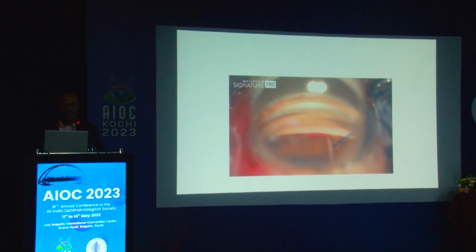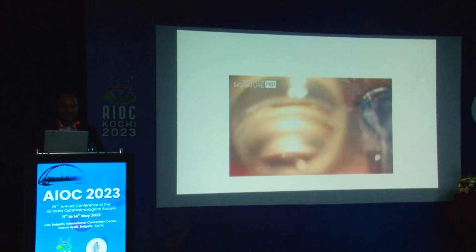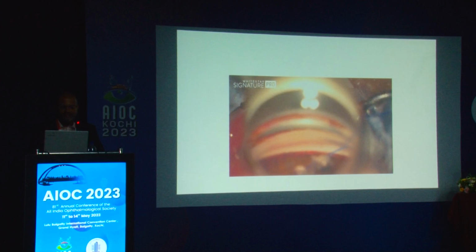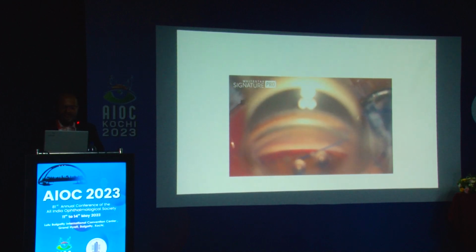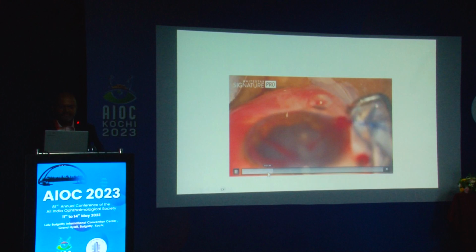And you could see the chemosis, the subtenon block was so heavy, and the suture just came out. So I have to introduce the suture again. When you lifted the lens, the suture came out. So be very careful, and then again remember the bubble trouble that always causes a problem. And once you have identified, blood is actually good, mainly because it helps you to identify where the incision has to be placed, blood in the Schlemm's canal.